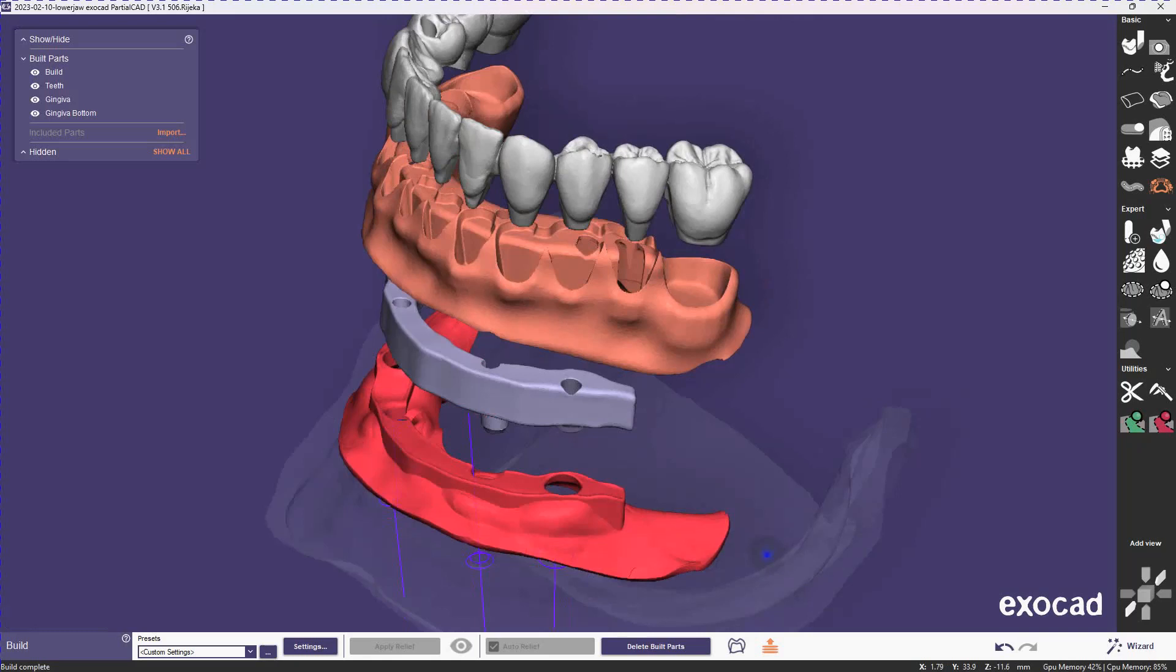Hi, this is Vincent Hammer from Exocad. In this video we're going to be looking at how to make a screw retained hybrid denture with a bar by tricking PartialCAD into doing a quick snap workflow.